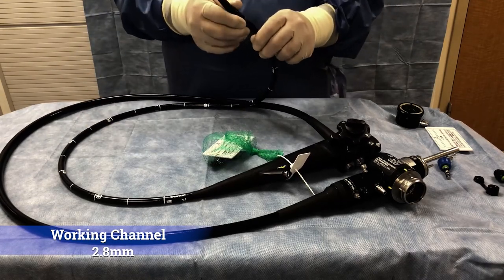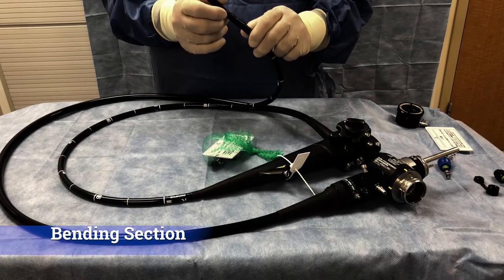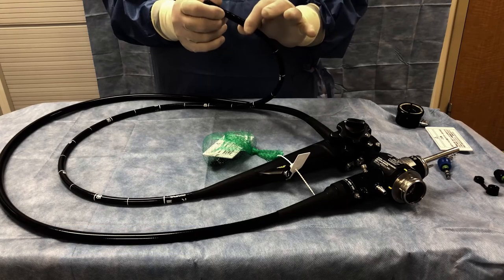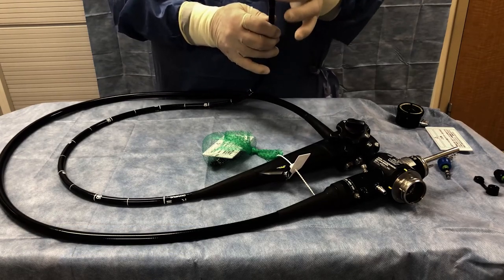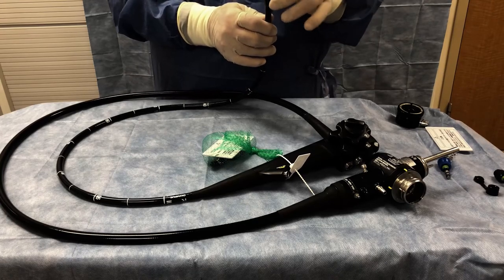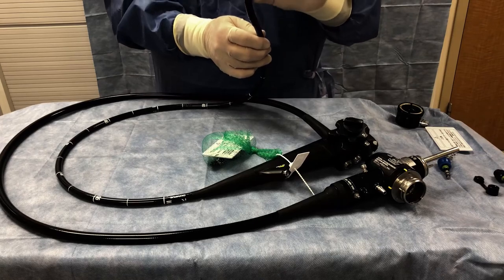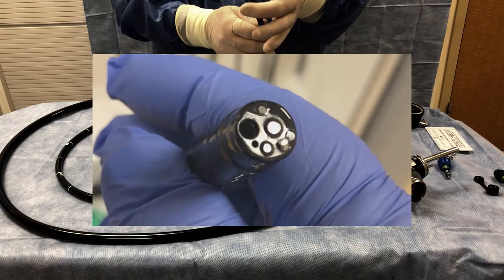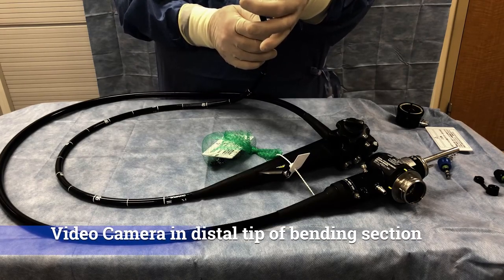What I am holding is the bending section. The bending section is the most delicate part of the scope — it is the one most prone to damage. It has a very flexible rubber covering over it. This last little bit right here, the last three-quarters of an inch, is actually the camera. There is a camera and a lens array in the very tip.